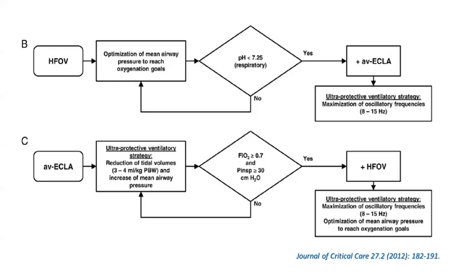This is just my view about the high frequency use in our cardiac ICU, or our experience with it. Now Chinese companies are trying to put this mode in other ventilators, and we saw it in the markets, but I never used it with anything other than Bear Cub and SensorMedics. So this is my comment about high frequency, and thank you guys for giving these interesting topics in the cardiac ICU. Thank you so much.